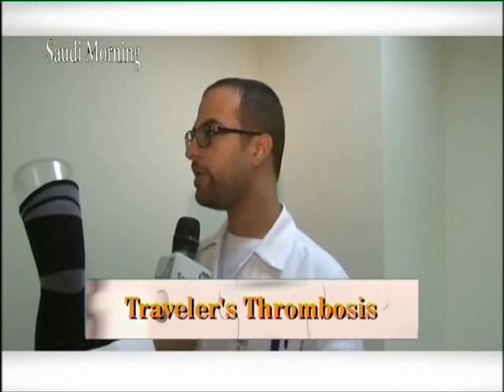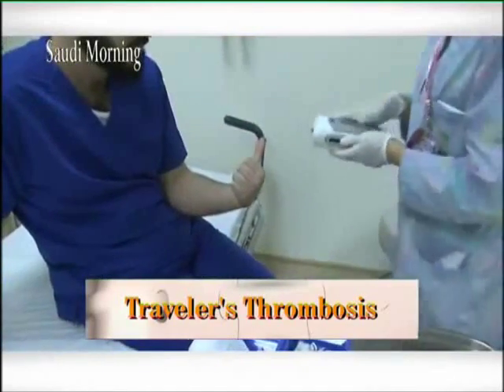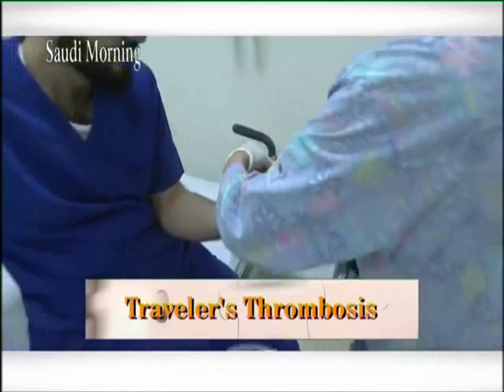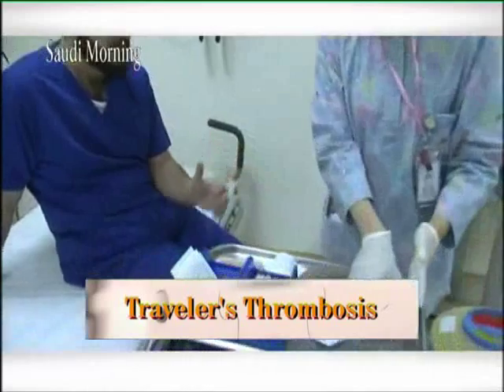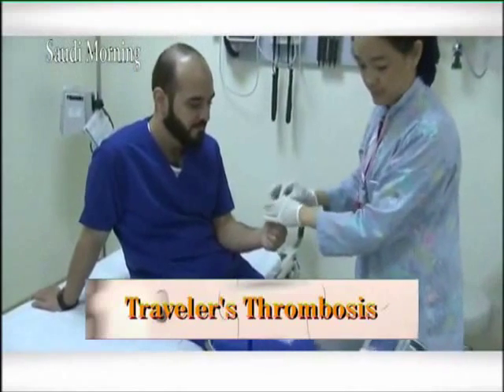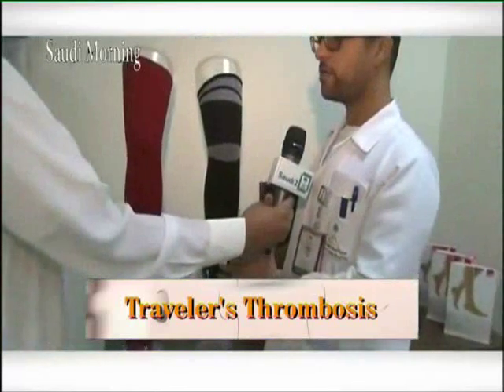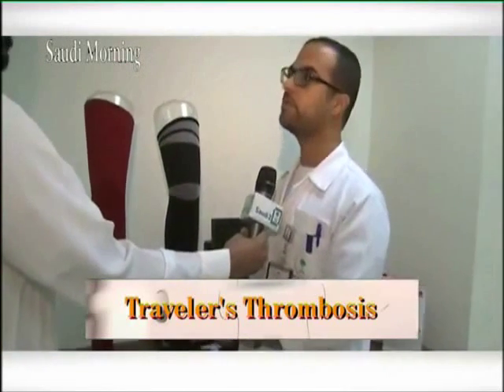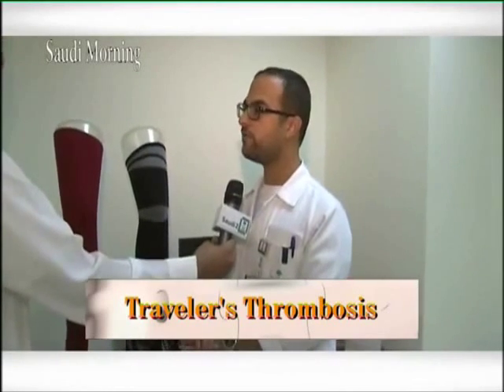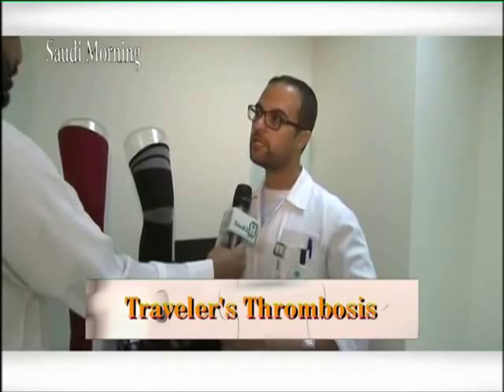Regarding the ready-made, usually we first take the measurement. If we are talking about the lower extremity and the patient has deep venous thrombosis or a blood clot there, after the patient takes his proper medication, like an anticoagulant, from the physician, we take the measurement from the ankle, calf muscles, and also the thigh. We take the biggest round measurement, then we see the best size for the patient and issue it for him. Then we give him education on donning and doffing, meaning how he can wear it and take it off.